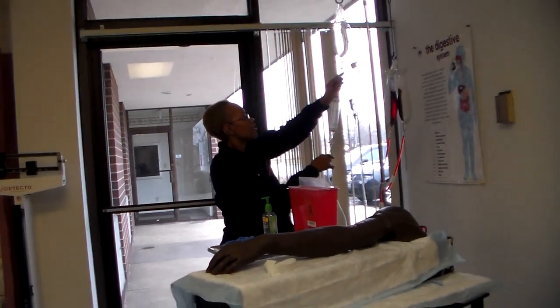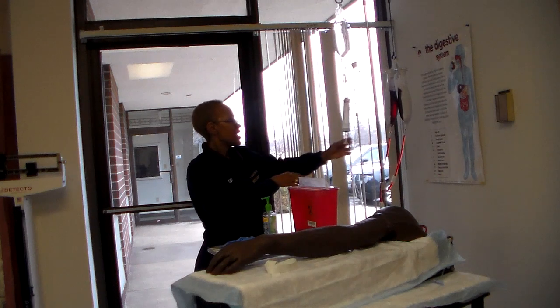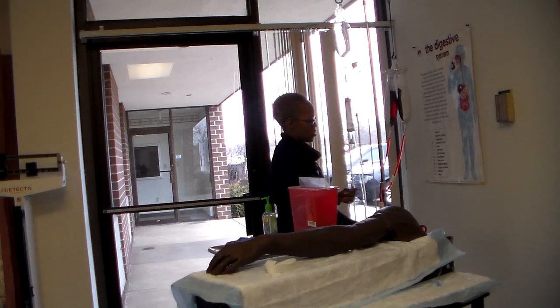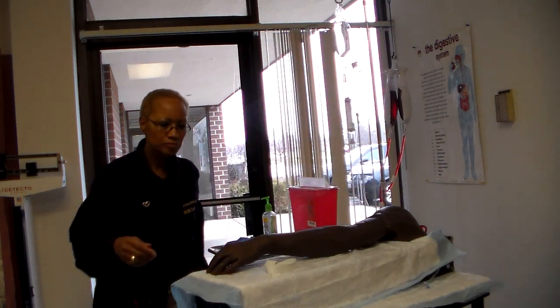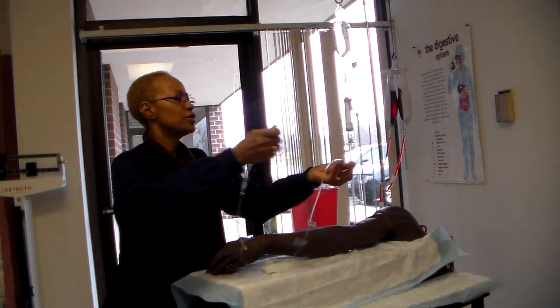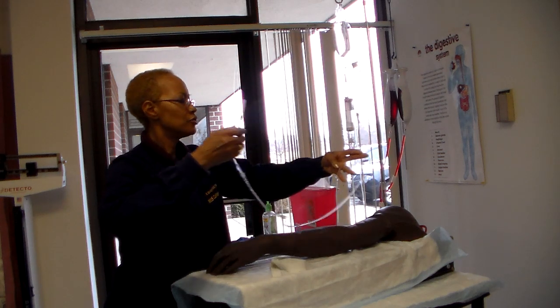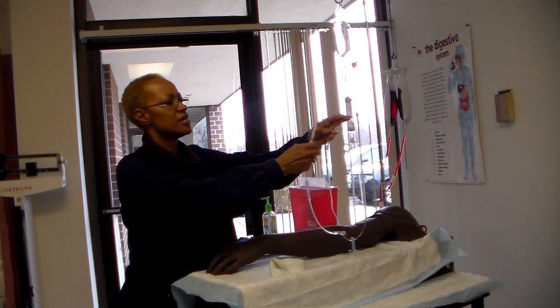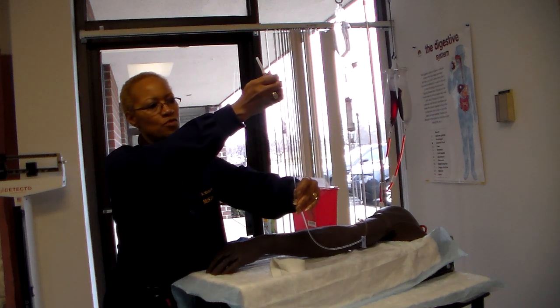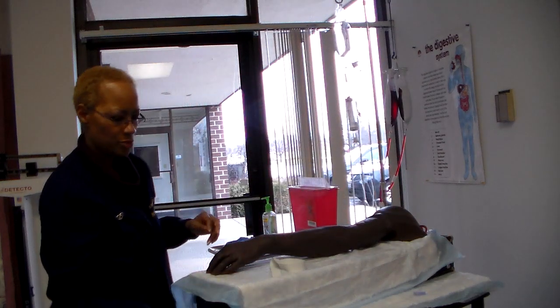Then open up my clamp, and I'm going to feel my Buretrol, and then I can open my lower clamp in order to purge through my tubing. Making sure that at each port, you turn the port as the fluid is coming by, you turn it upside down and get the air out of the port. Because later you may be given medication through those ports, and you don't want air surging in the ports. Okay, so you purged it all the way through.